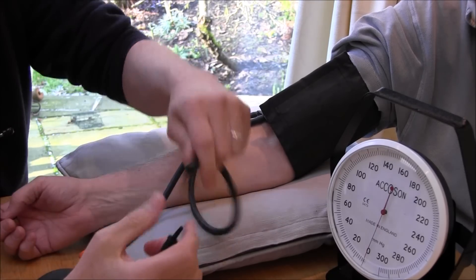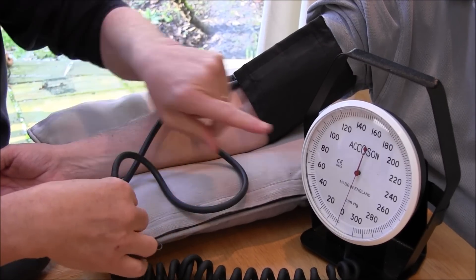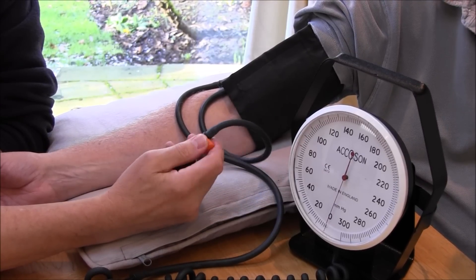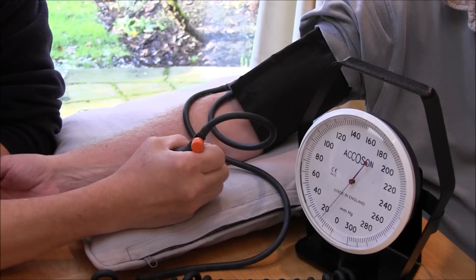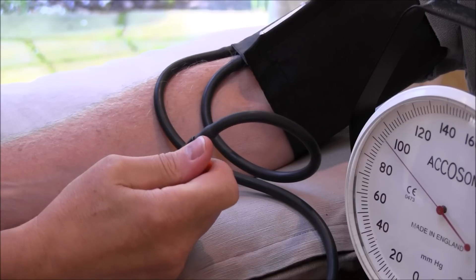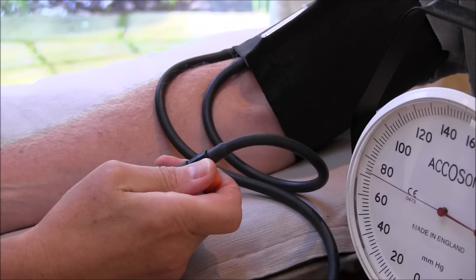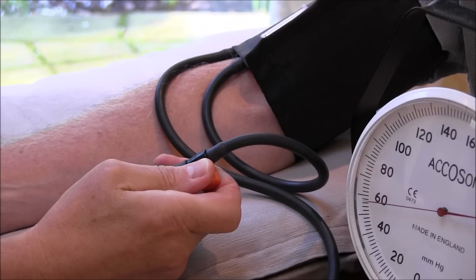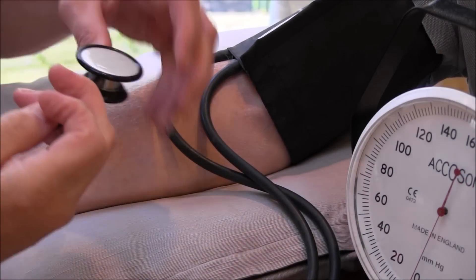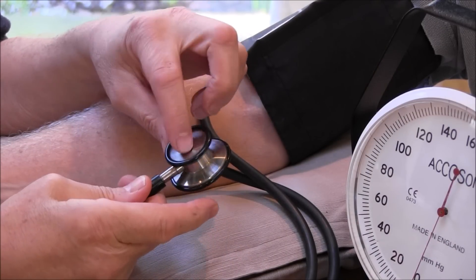I'm now going to connect up to the pressure gauge, the manometer — and as we can see, that's calibrated in millimeters of mercury. I'm going to tighten that up, and when I screw that, I can start pumping up — you'll feel the pressure there, Bill. To let the pressure down I'm going to turn it the other way. With a bit of practice you can control this quite precisely. Now I'm going to listen with a stethoscope — with the diaphragm side. Just make sure I'm open to the diaphragm side.